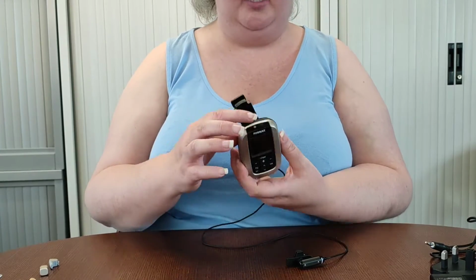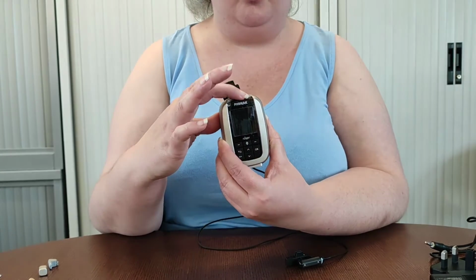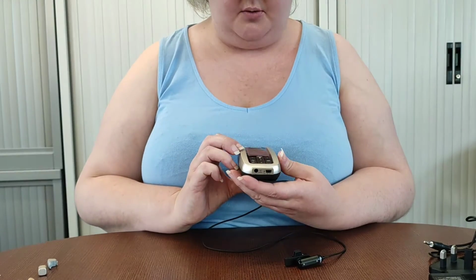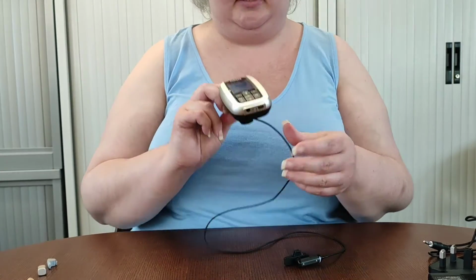So the first thing would be that we need to turn it on. So we have this slider at the top. So we're going to slide that across so we have the green, so we can see that that's turning on by the display screen. So we're going to wait for that to start up. So we've got that ready and going, it's on.